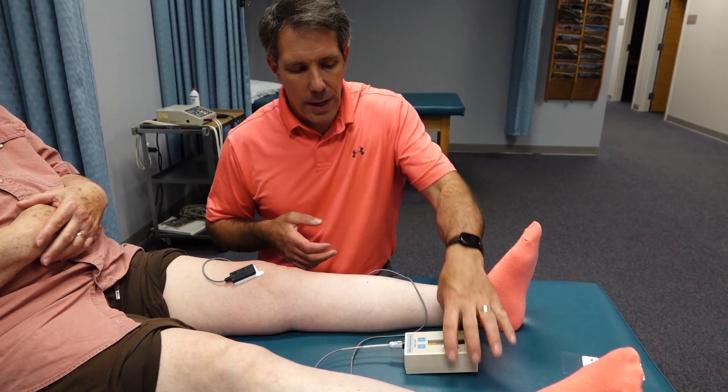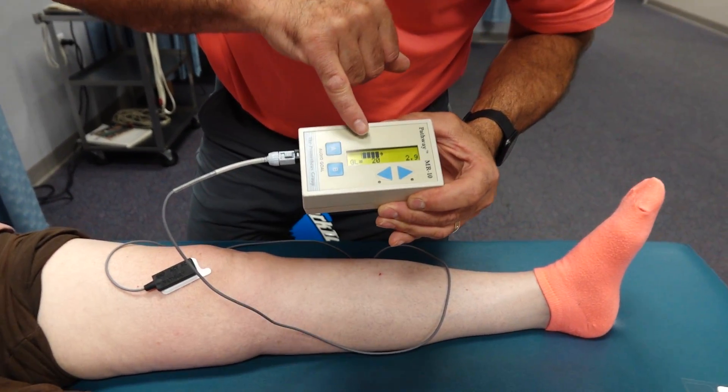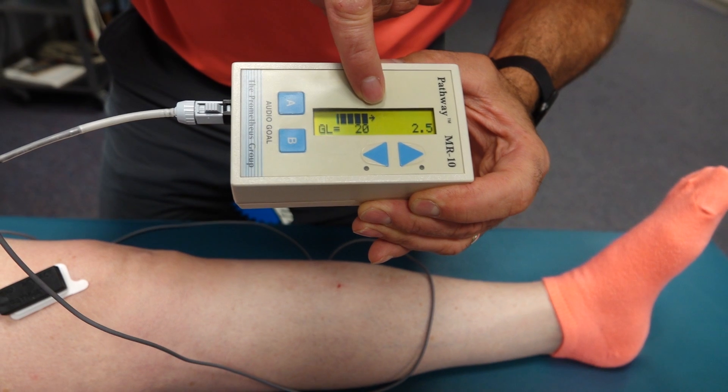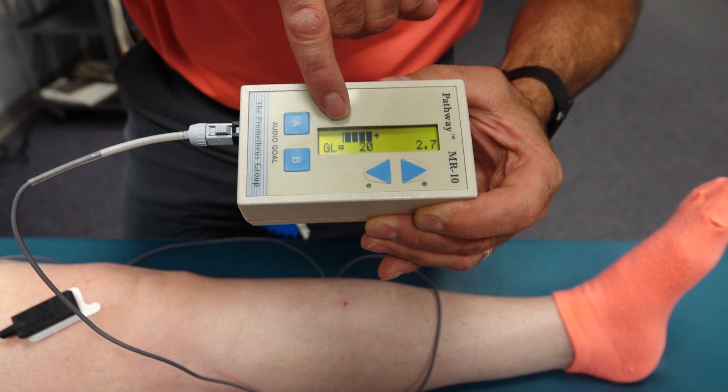We're going to do a little demo here. So what I did was I set her biofeedback — and the arrow is her goal. You can see that she has some activation going on in the quad right now, just sitting there at rest.